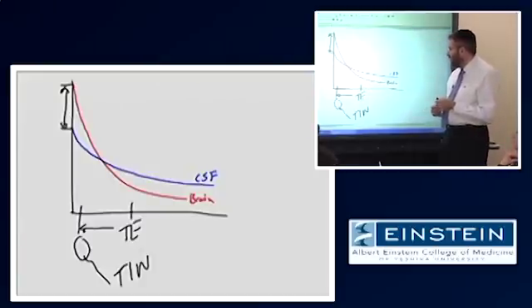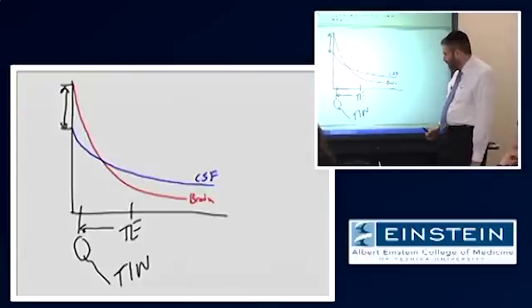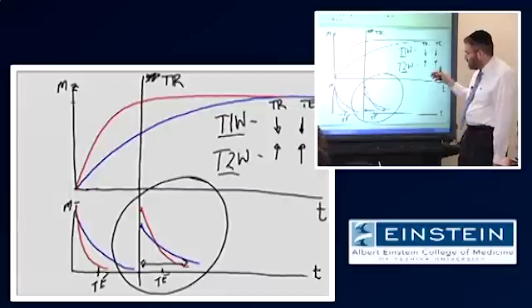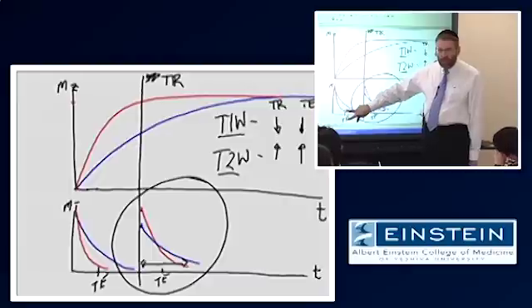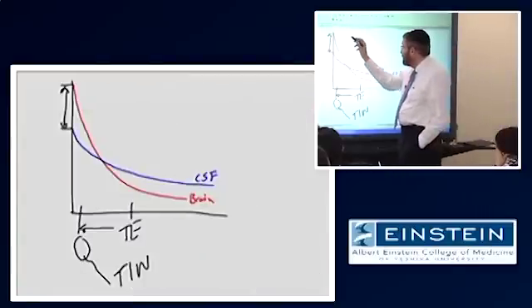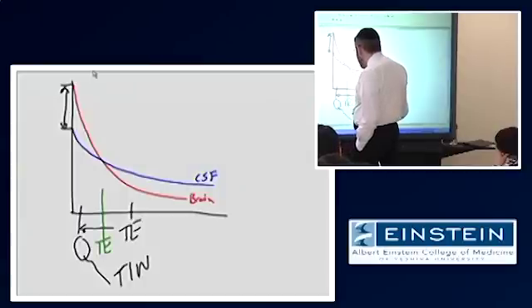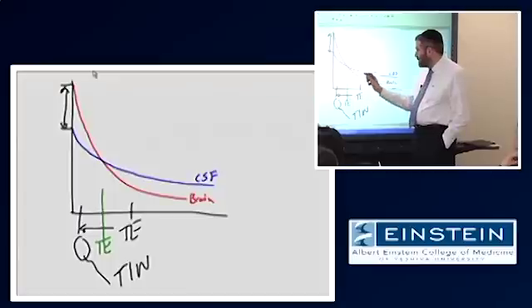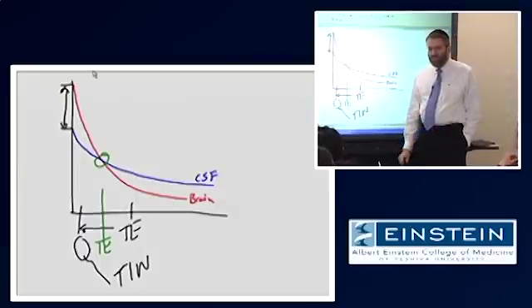Okay? And if you wanted to maximize this contrast due to T2 differences, you would probably be better off with our first example. If the TR is as long as possible, then with the same TE, you're going to get an even larger difference here. Your CSF will be much brighter than brain tissue. Now, what happens if we place our TE there? They look the same. These crossing points are something you have to be aware of. So in this case, the CSF and the brain would look relatively similar.